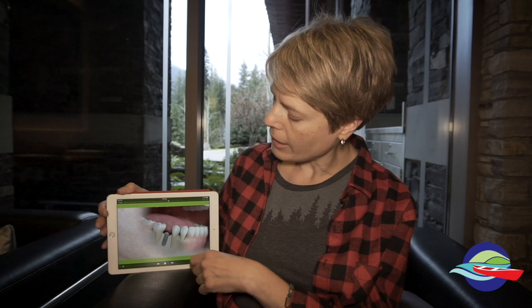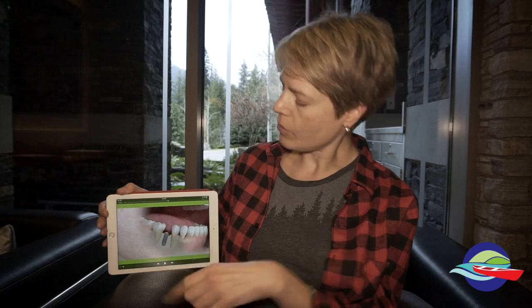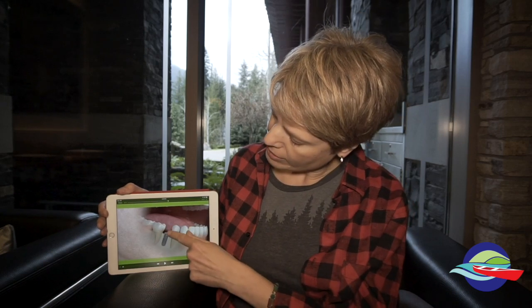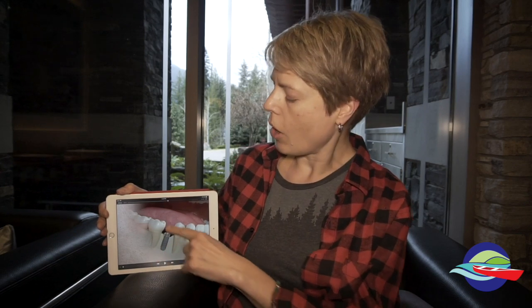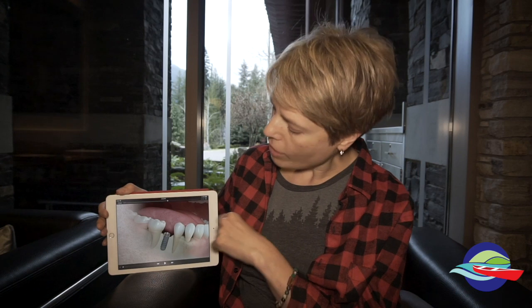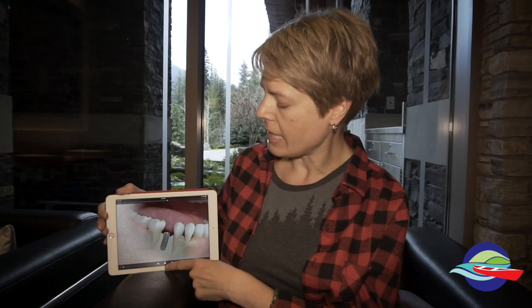And initially, when it goes in place, it has what we call primary stability. So the implant is solid within the bone or stable within the bone, but it's not yet ready to chew on. So I explained to the patient that we seal this little area off on the top here with something called the closure screw, and that prevents the tissue and bone from growing into the area where the crown will go later on. And we put a couple of stitches across that area just to seal off the small incision we've made in order to place the implant.